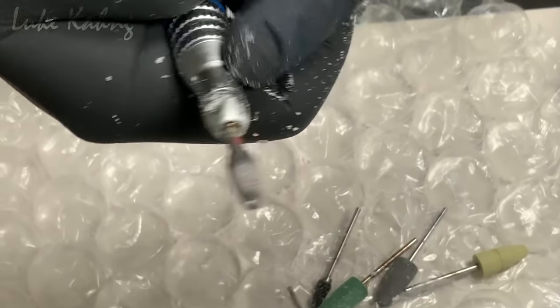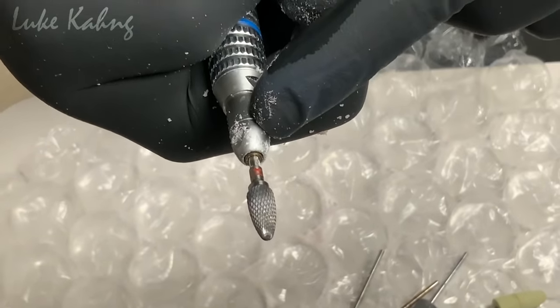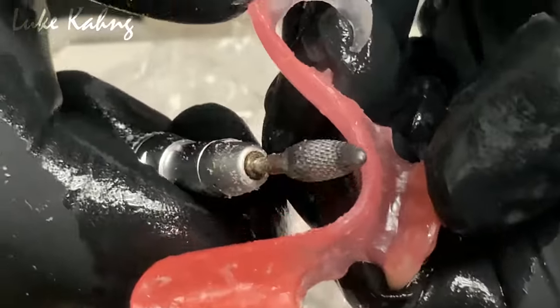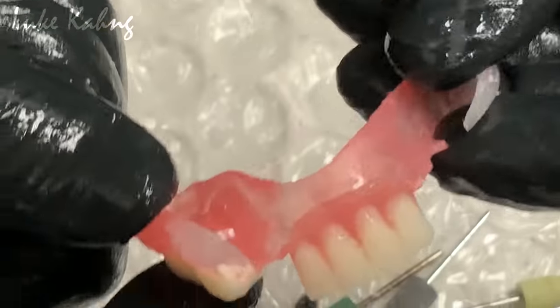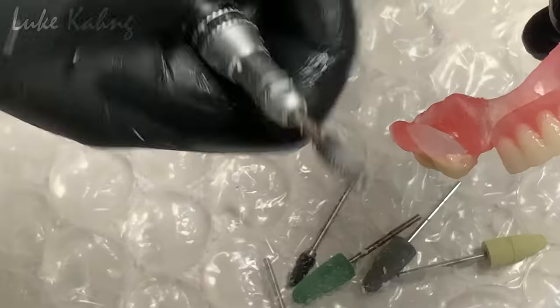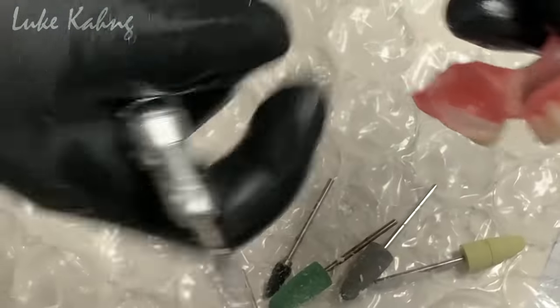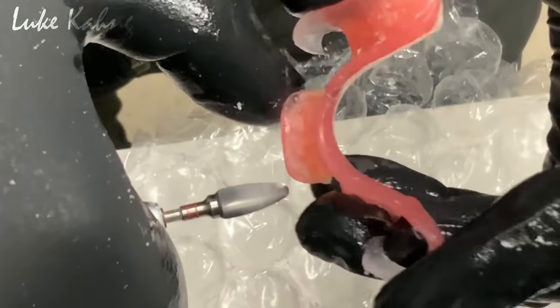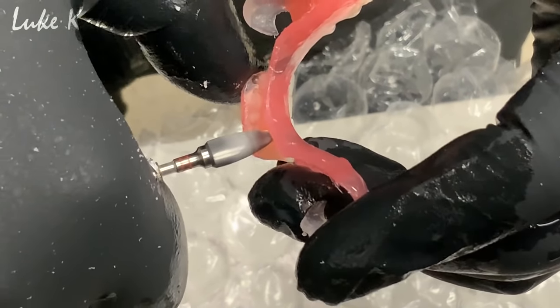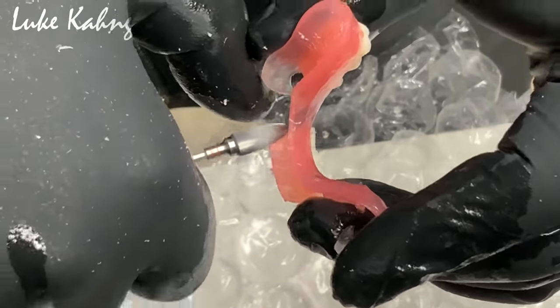You have to just keep this one as part of your armamentarium for removables. This is the way to go. Yeah. It leaves very little behind for you to clean up. See? That's the difference after adjusting it with this right here. This should be a standard for you to have in the dental practice. Cool? Very clean. Always towards you.